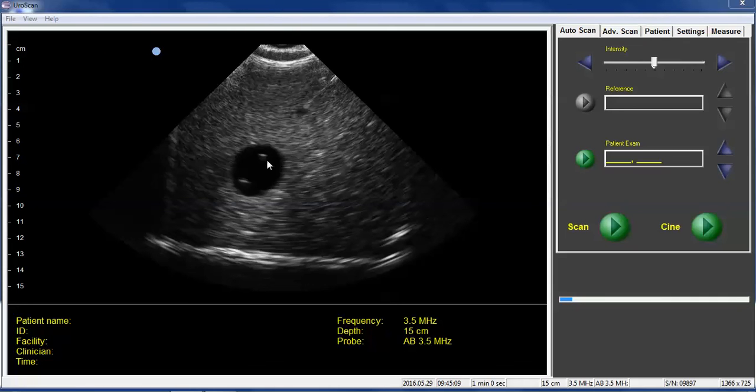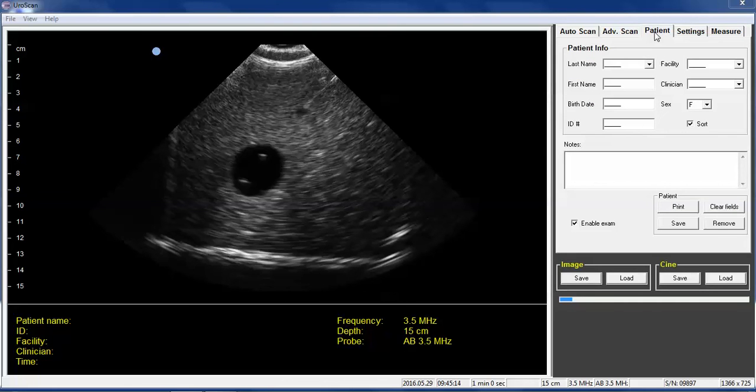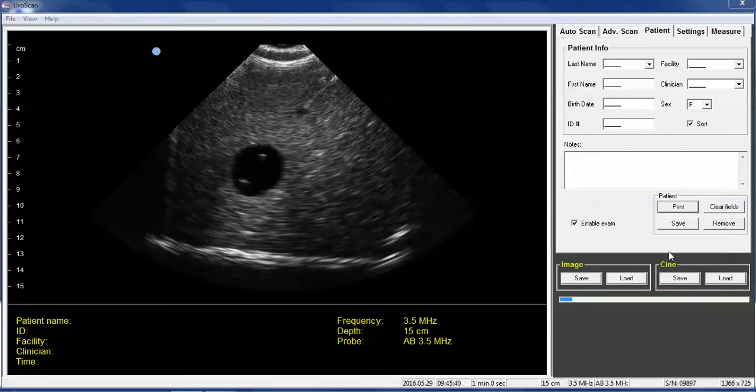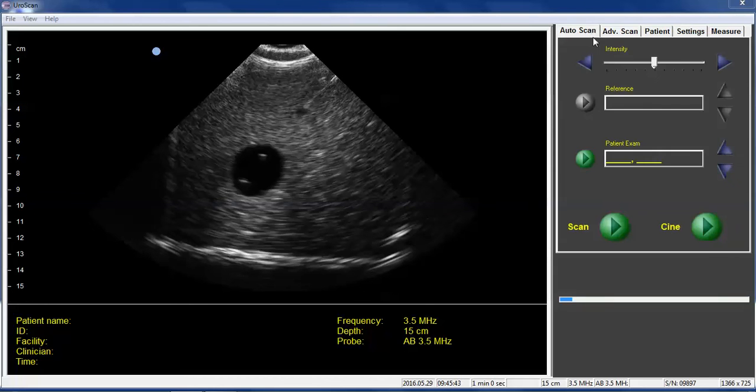So at this point, if you do want to print the report, you go to the patient tab, then you push the print button. You want to make sure that most recent is checked off to print the most recent report. If it's not checked off, then the system will print the entire day's worth of reports. So unless you want to do that, I would make sure that that is checked off so that you have the most recent report. After that, you can move on to the next patient.